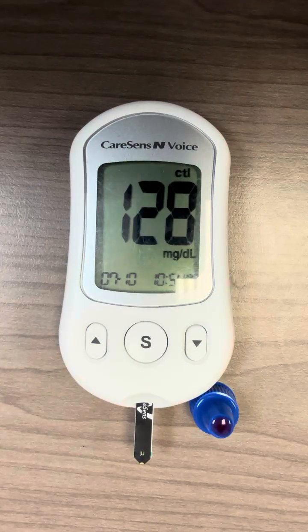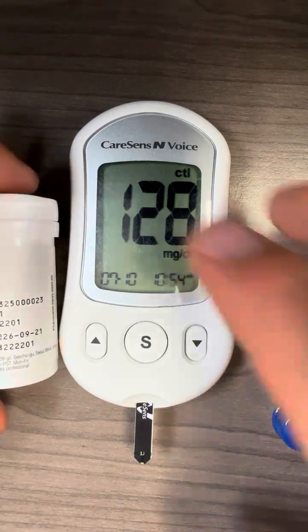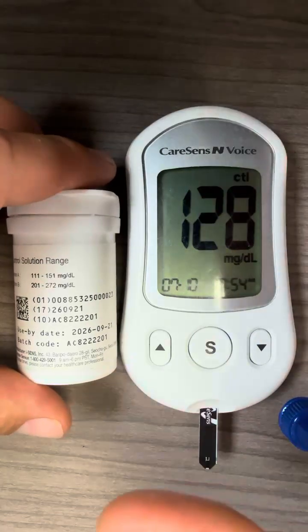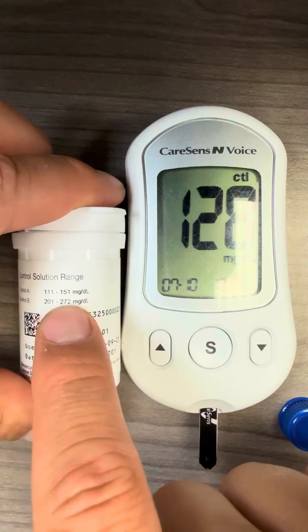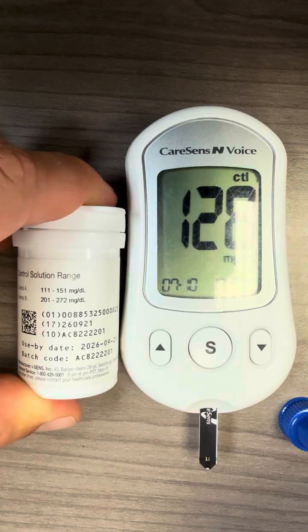Your control solution test result is 128 milligram per deciliter. You can see that 128 is shown, which is between 111 to 151, so it means that the meter and the test strip is working properly.